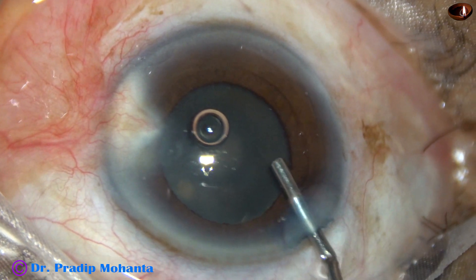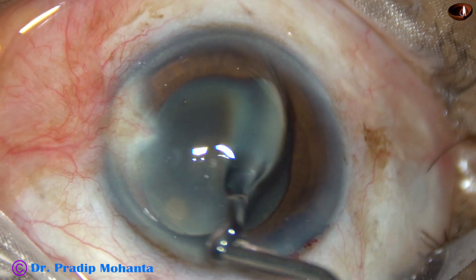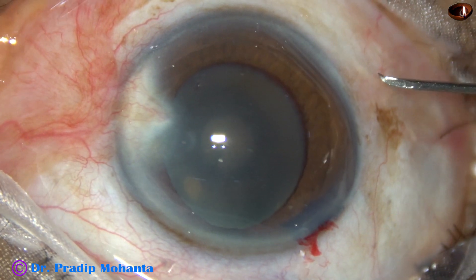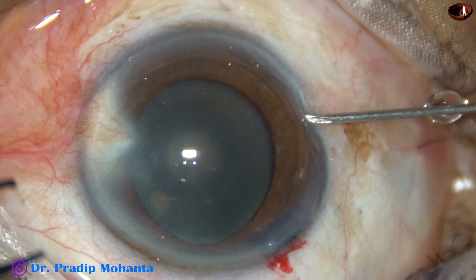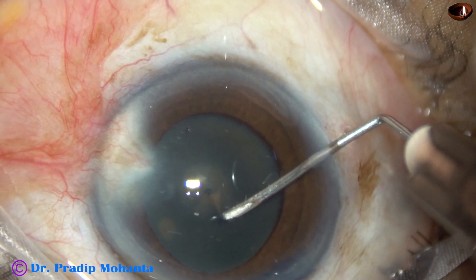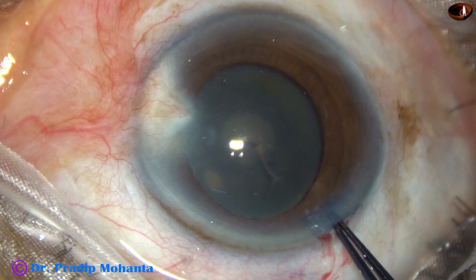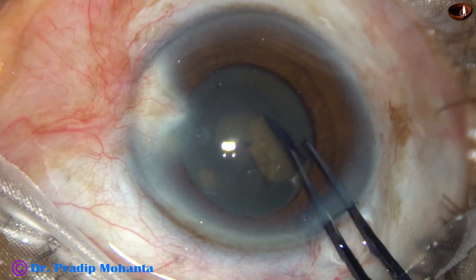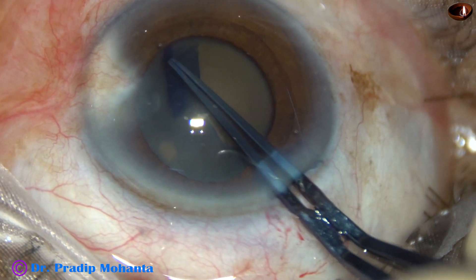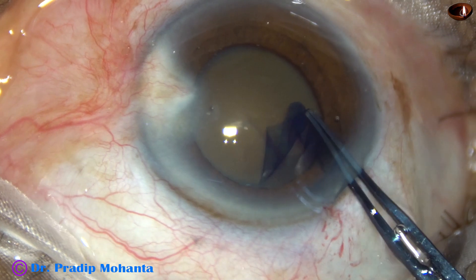Viscoelastic substance is injected into the anterior chamber and applied over the cornea for better visibility. Now is the time to do capsulorhexis. In this case, I used a 26-gauge bent needle to incise the anterior capsule, creating a large capsular tag which can be held easily with the utrata forceps. I go along the border of the pupil, all around, to get a rhexis of adequate size — a rhexis of about 5 mm.